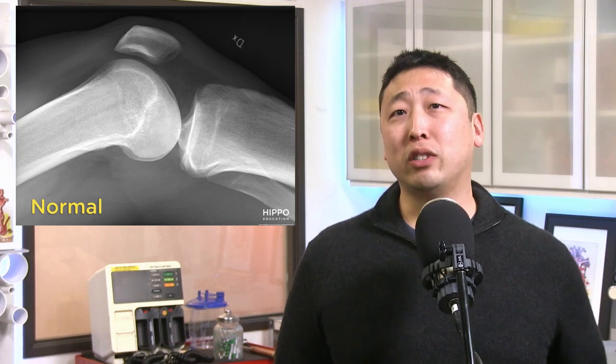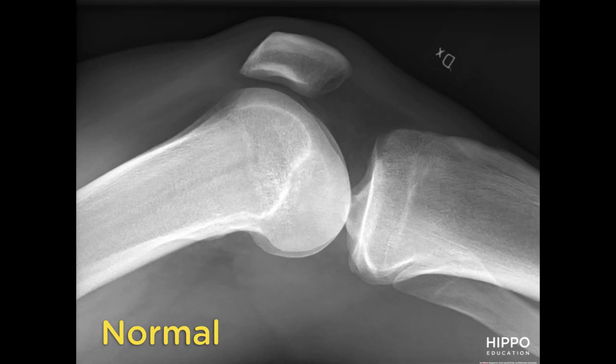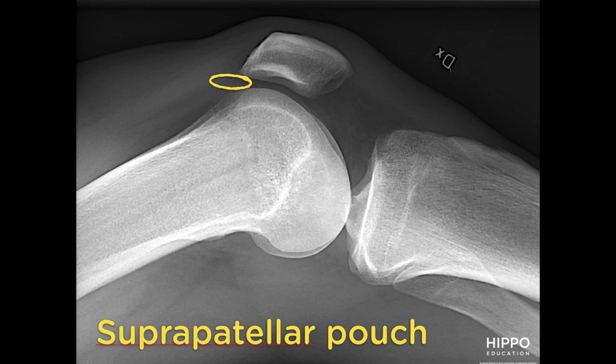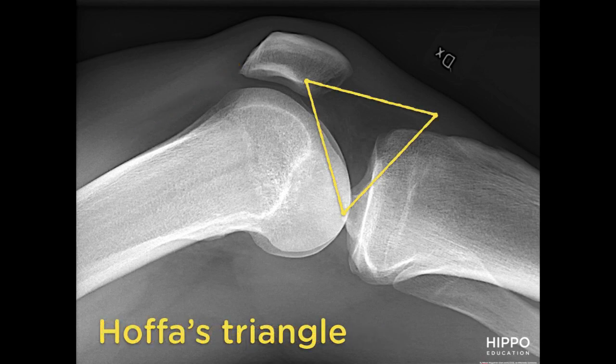Now this is a normal lateral knee x-ray. There are four main structures to note. First is the suprapatellar pouch — in a normal knee, the suprapatellar pouch is not prominent. Second, you can see that the quadriceps tendon is straight and the posterior border of the quadriceps tendon is clearly defined and not blurred in a normal knee x-ray.